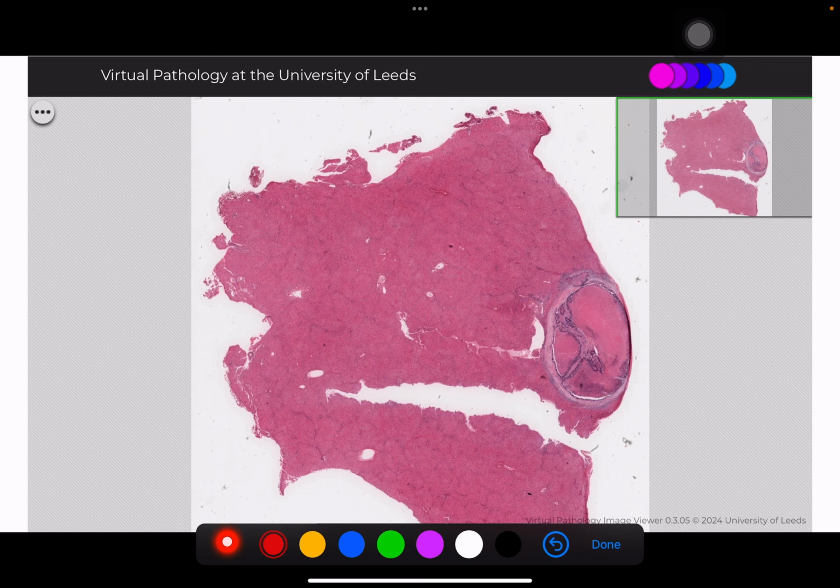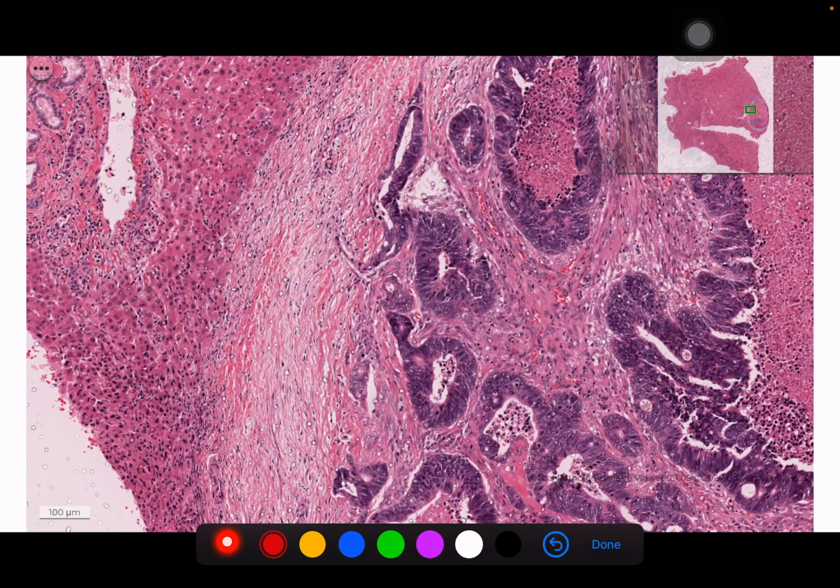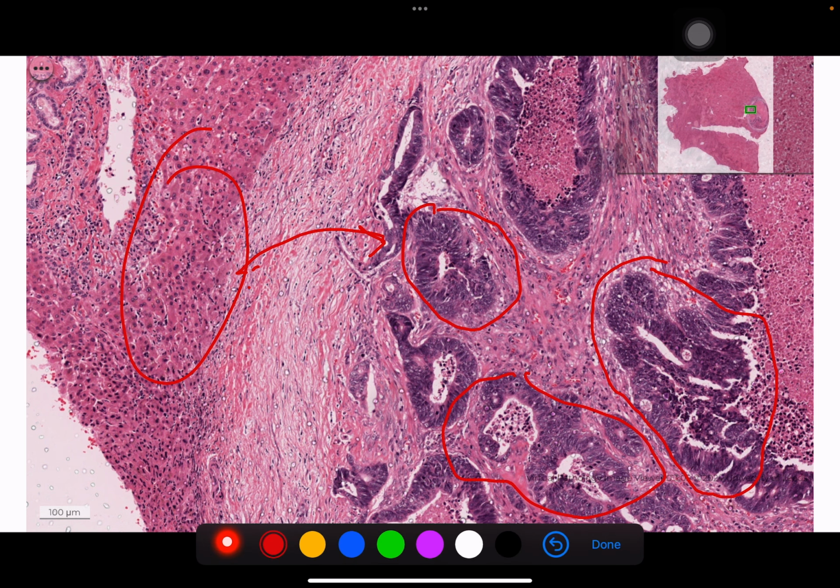And the last one is metastatic carcinoma, liver carcinoma. This is the section of the liver where this is the nodule of metastasis. When we open properly, you can see there's liver tissue there, but suddenly there's a malignant gland. This is a malignant gland coming from the bowel. So this is a colorectal carcinoma that metastasizes into the liver, and you can see the 5 features of malignancy there in the malignant glands.